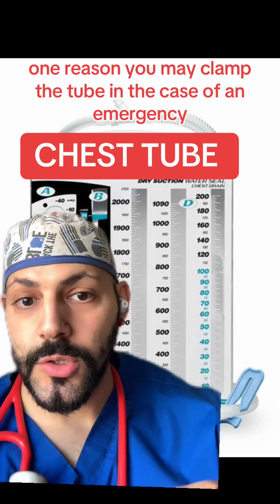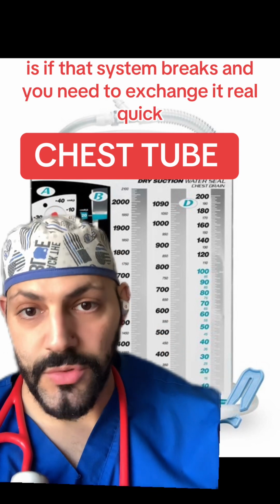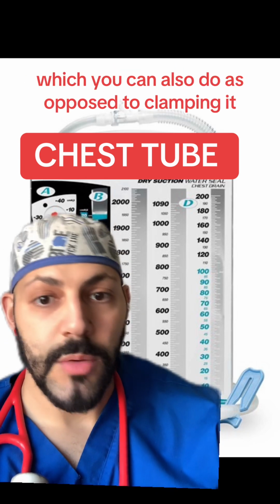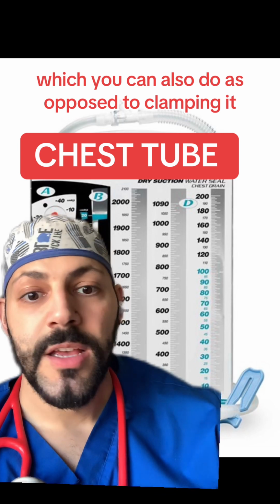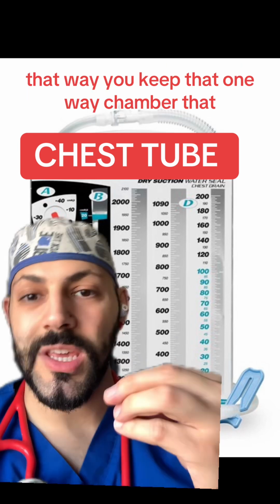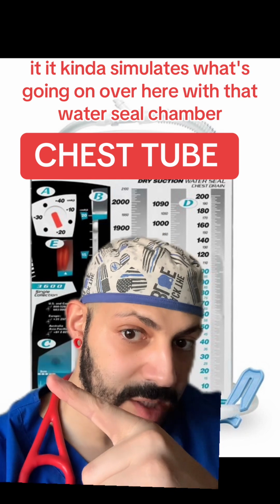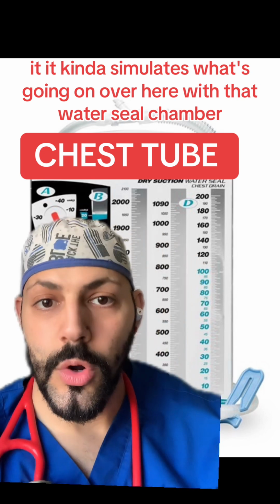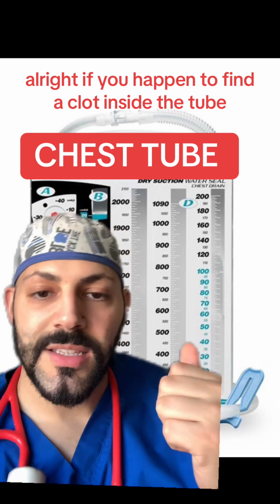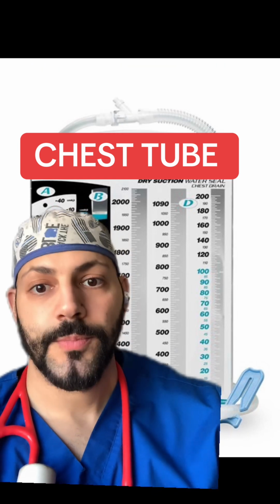One reason you may clamp the tube in the case of an emergency is if that system breaks and you need to exchange it real quick. You need to clamp the tube really quickly while you get another chest tube and replace it. What you can also do, as opposed to clamping it, is you could take the end of that tube and place it into a cup of water, right? That way you keep that one-way chamber, that seal, okay? It kind of simulates what's going on over here with that water seal chamber, all right? If you happen to find a clot inside the tube, you should not be milking, all right? You don't want to be milking the tube.